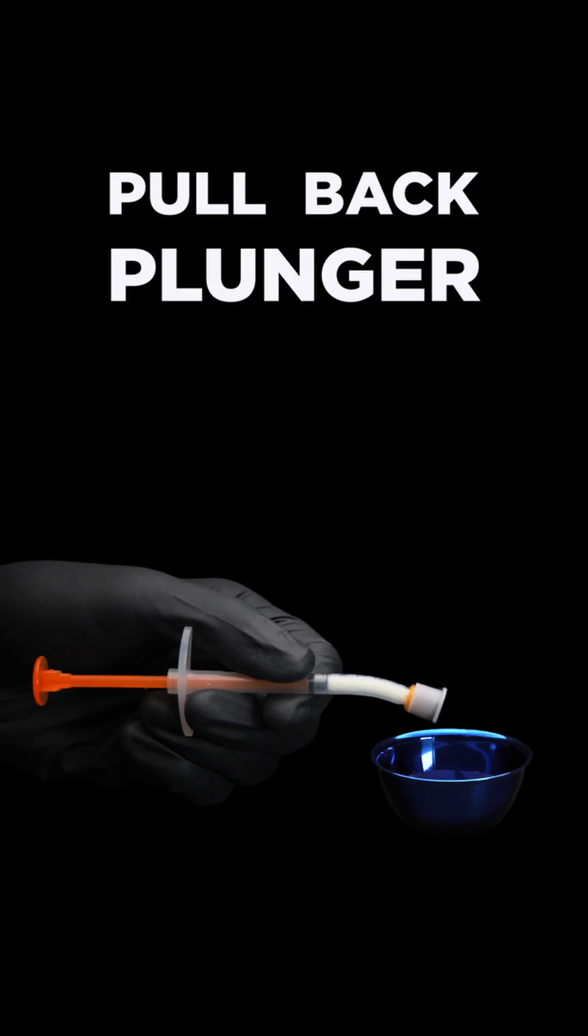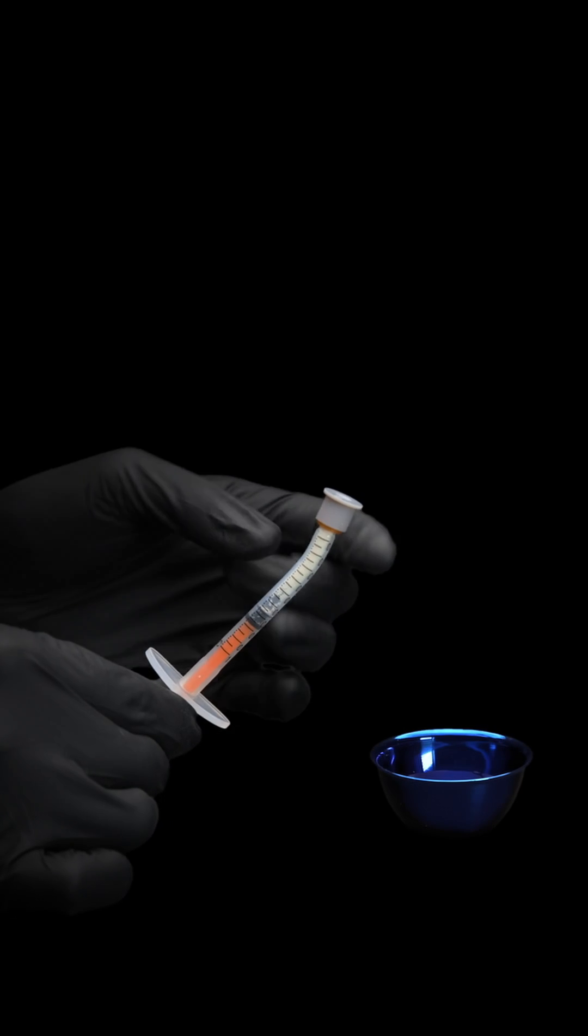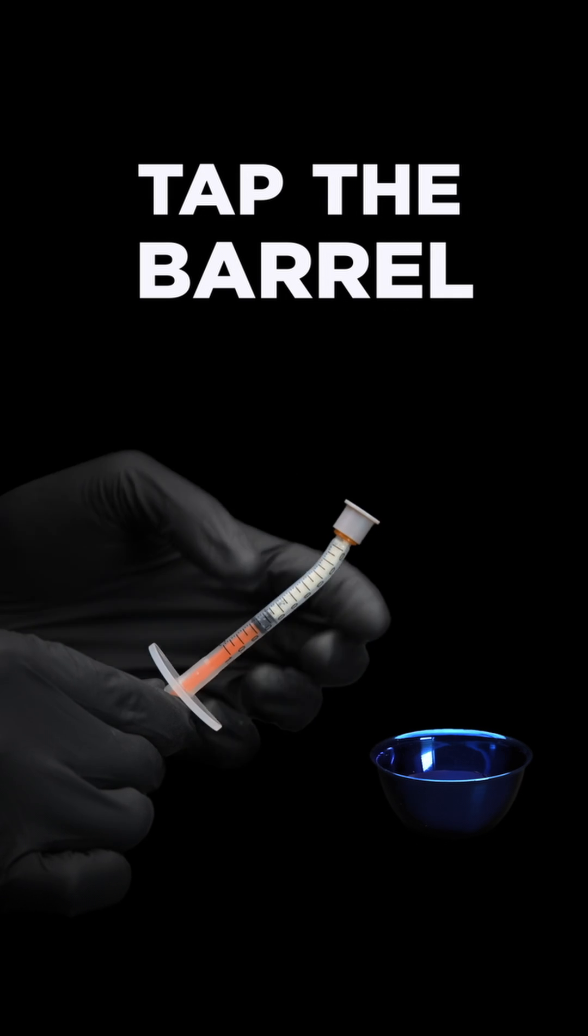Start by pulling back the plunger about halfway, giving extra space behind the particulate. Holding the syringe plunger side down, tap the barrel multiple times.